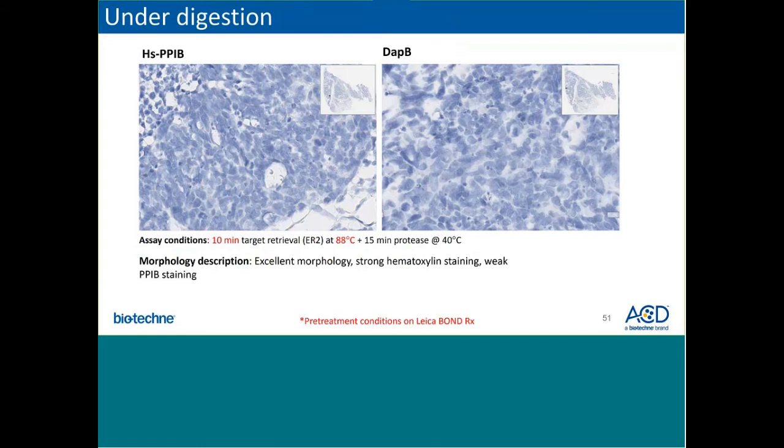In the opposite direction, here are some samples that have been under-digested. So the PPIB staining is much weaker than the first two samples, and the tissue morphology looks great, showing no signs of over-digestion. Again, these pretreatment conditions shown here are on the Leica BOND RX.